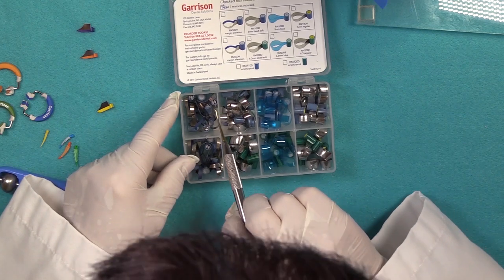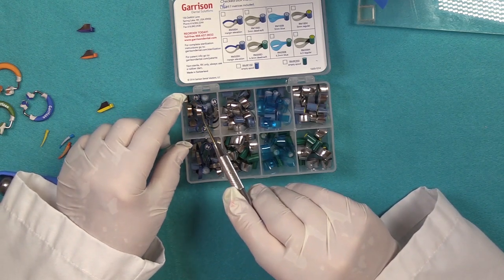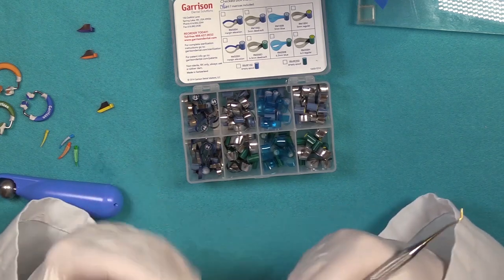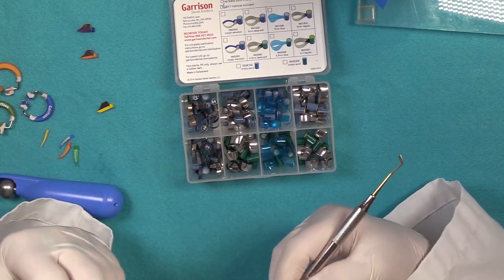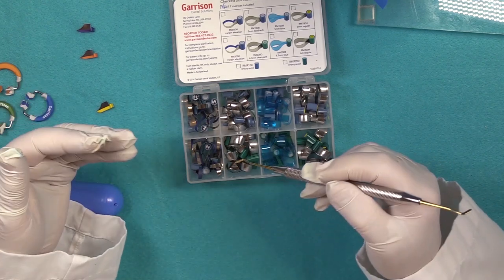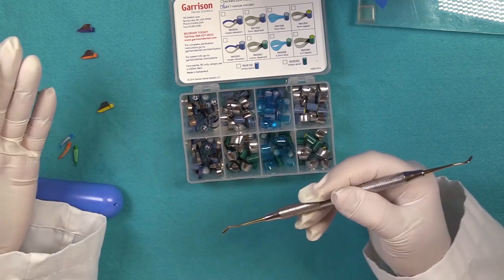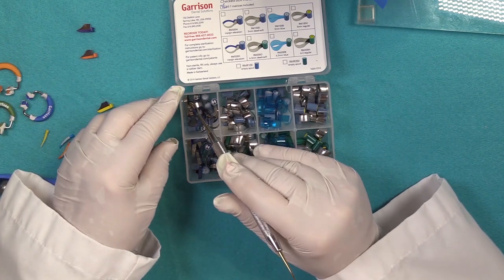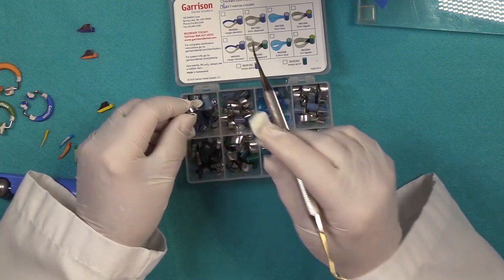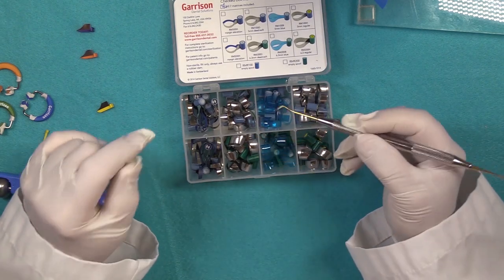This particular matrix system is called the margin elevation. What that is for is if you have a tooth that you're preparing for a crown and the margins are subgingival — if you're doing a scan, you need to build up your margin so it's supergingival to get your image. They also have a coating on the inside which helps with removal, as it can be a little tricky removing those when placing them subgingivally.